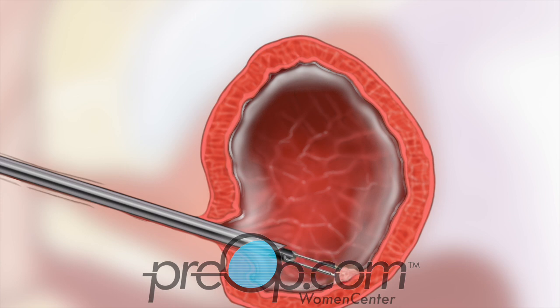The tumor is cut away from the bladder in small pieces using the loop. Your surgeon uses suction to carefully remove those pieces from the bladder. The loop is also used to stop any bleeding that is seen.